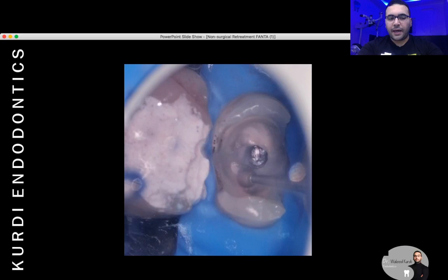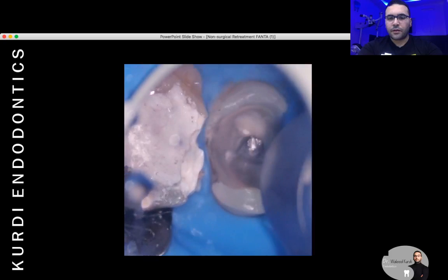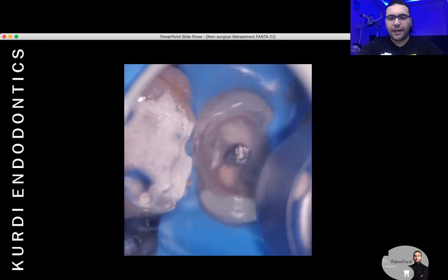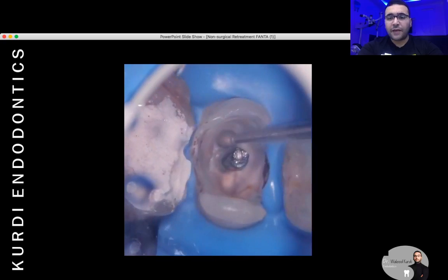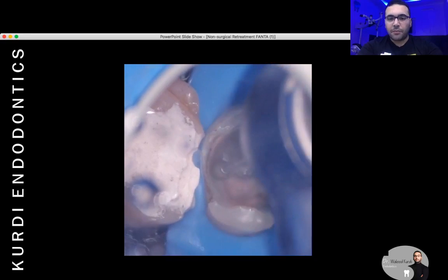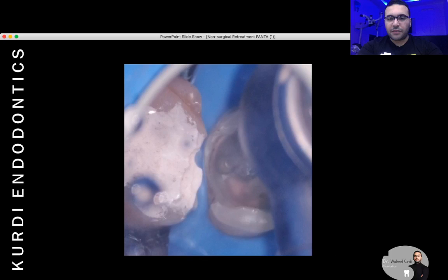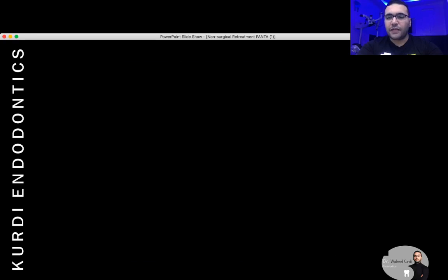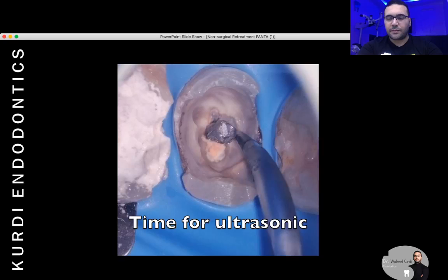And also we had this kind of metal post, and I will repeat this video again in the end of our lecture, but I'm just showing to you how we should make this kind of non-surgical retreatment.